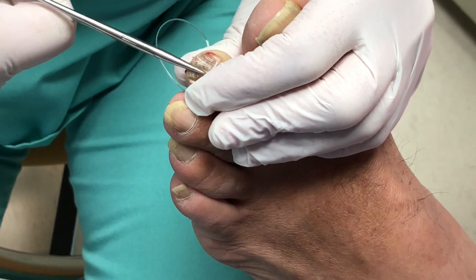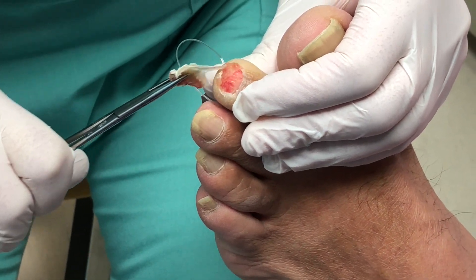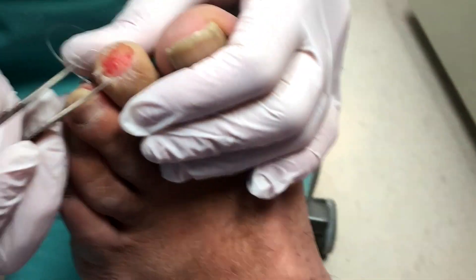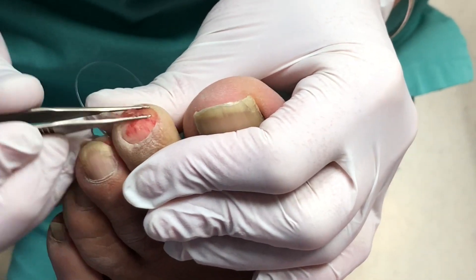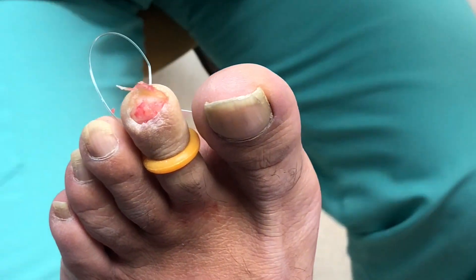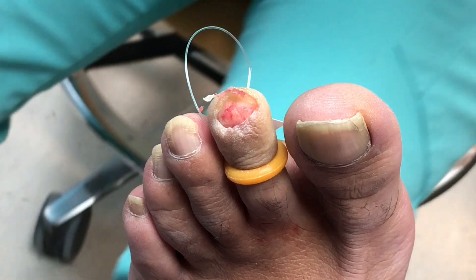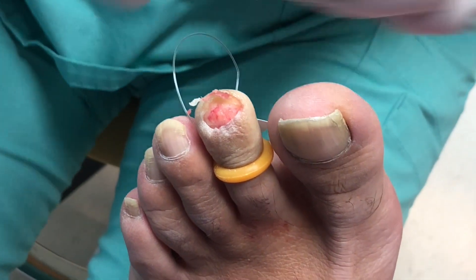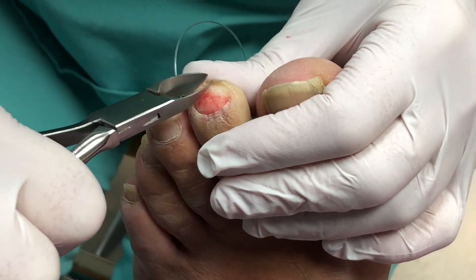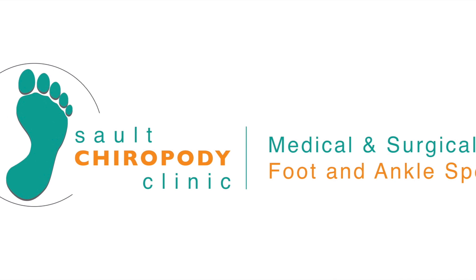Oops, squished it. All right, here we go. Look at that. I'll just clean that up, take away all that hard skin right here. And there we go. Bye.